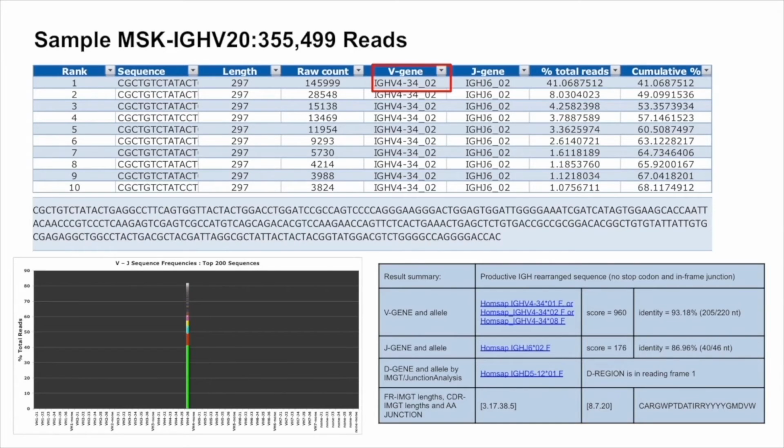patient's disease. Very briefly, on my last 2 slides, we're also using the assay for somatic hypermutation. So every single sample, regardless of whether it is a CLL or not, we do the somatic hypermutation. This is how the somatic hypermutation assay looks like with the LymphoTrack assay. In this case, you're getting the same output as you would get for the IGH, but it also gives you the assessment of the somatic hypermutation. So you look at basically how much identity you have on that sequence compared to the germline sequence.